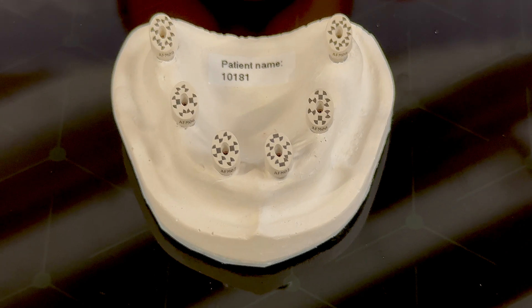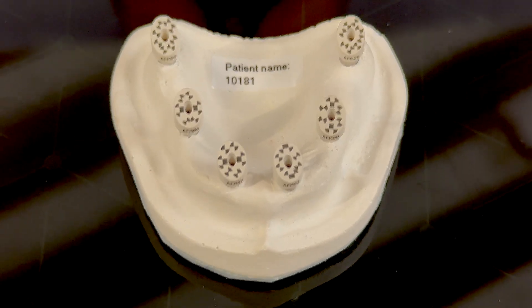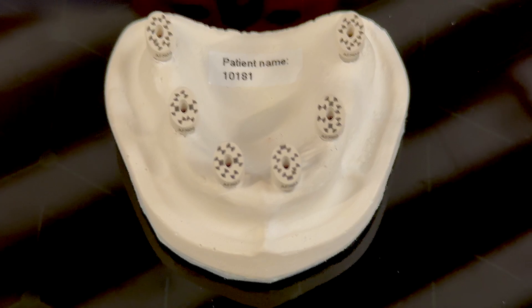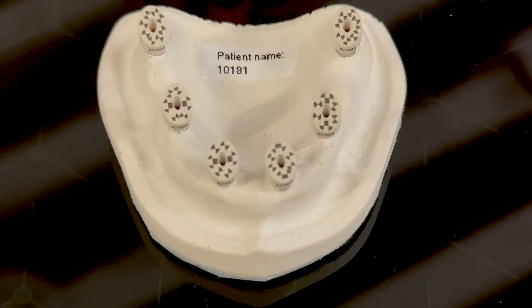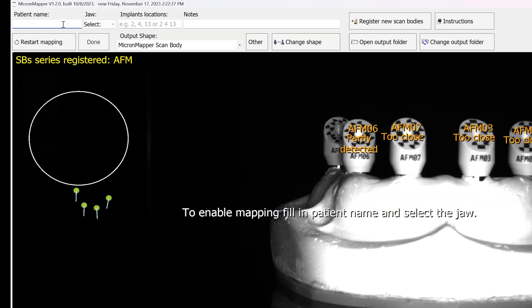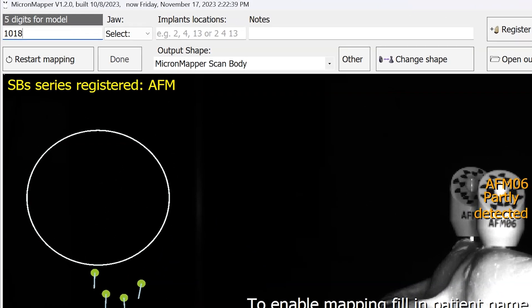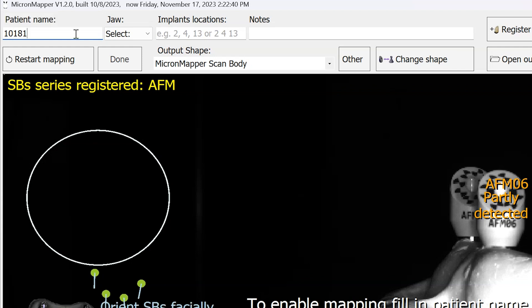You'll begin by placing six of your included scan bodies on your model. Next, locate the patient name printed on the top of your model and enter it in the patient name field of the software, along with selecting an upper jaw.